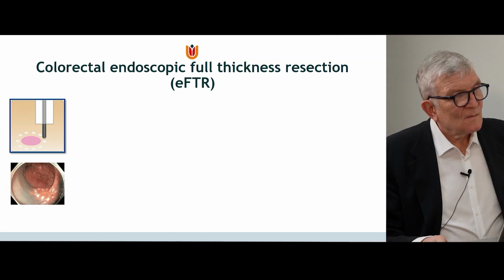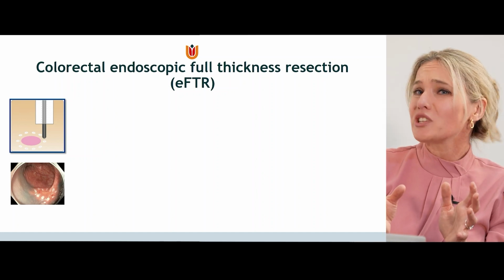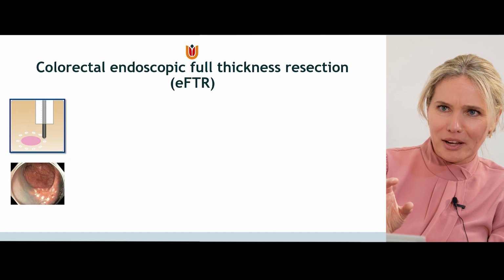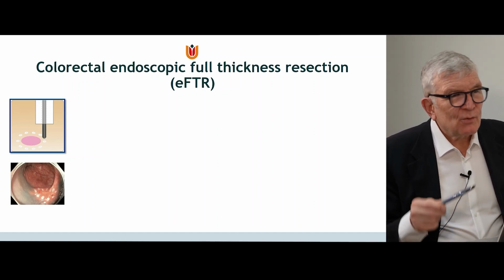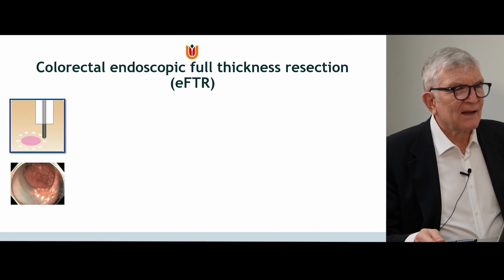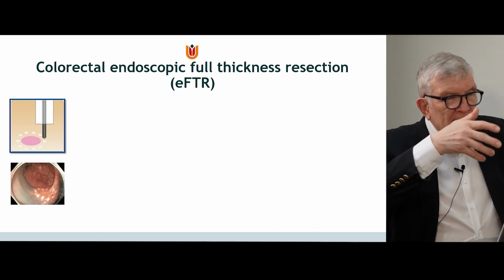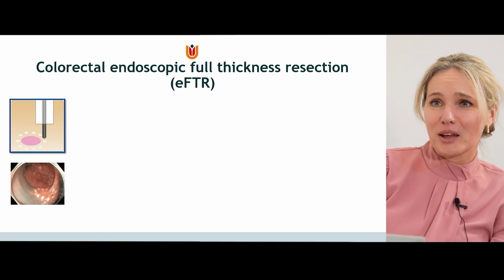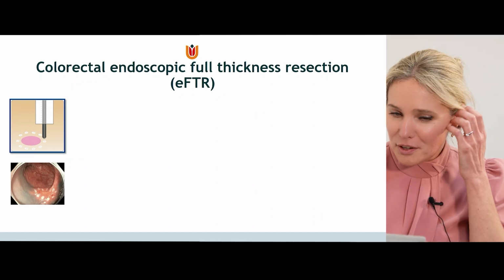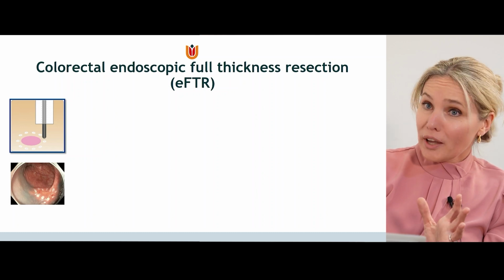So marking of your target area, you think it's not important, but usually it's important to recognize the right spot. That's a very important message, because if you see a lesion clearly with your super endoscopes, you think, I don't need to mark. No. But then you go on with this huge cap, you have collected a little bit of dirt higher up in the colon and you see nothing. No, that's right. So markings can really help. That's important, without the long cap, of course.